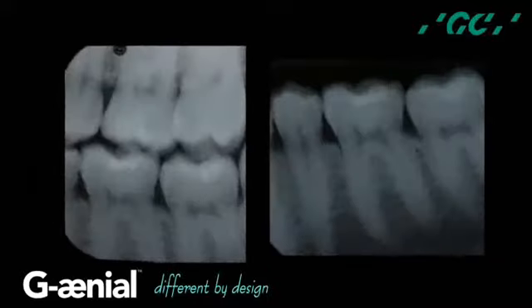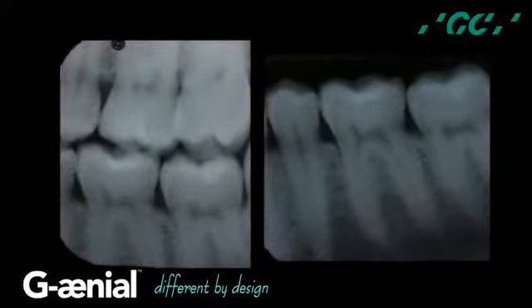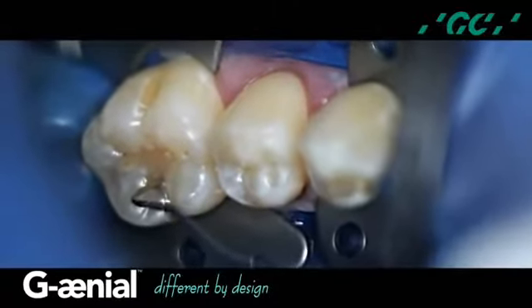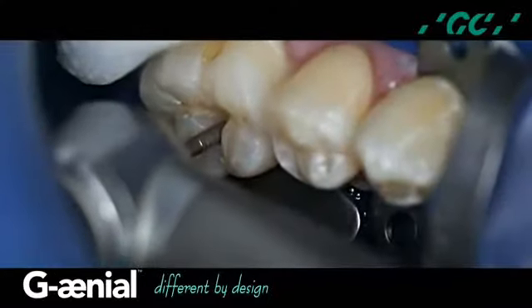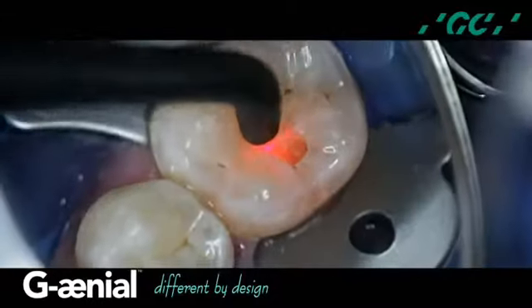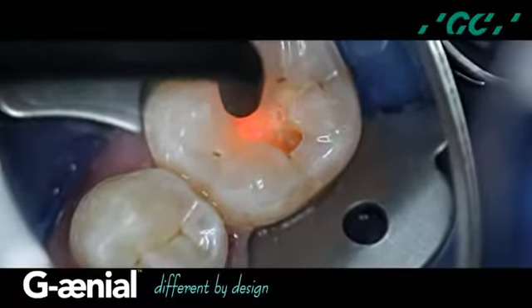After radiographic evaluation, a visual and tactile inspection of the defective restorations and recurrent decay is performed using 1112 Explorer by Ufridi. The existing composite restoration is removed with a high-speed composite removal burr by Brasser using a water spray. A second evaluation and identification of the carious tissue using the G-aenial.